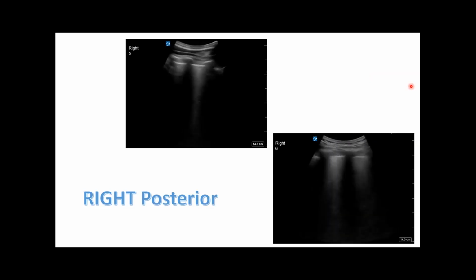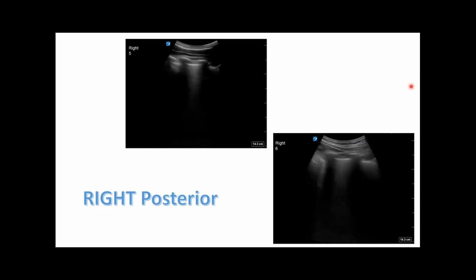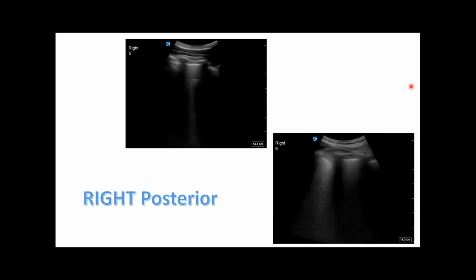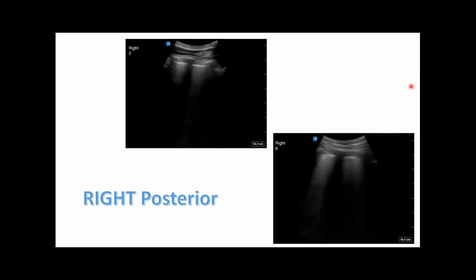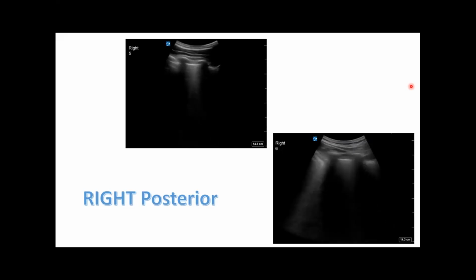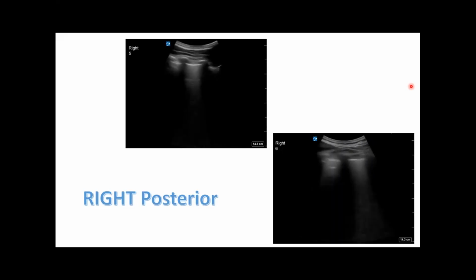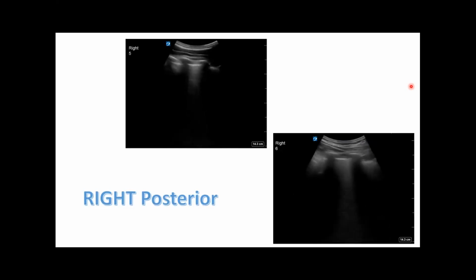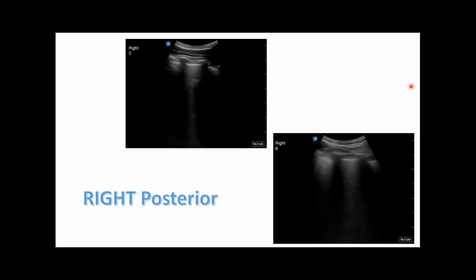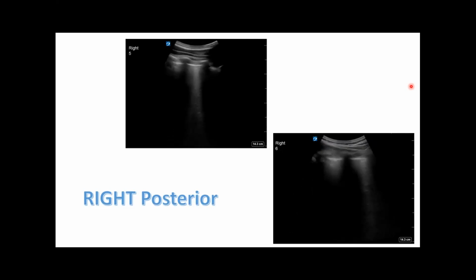Thank you. This is also something that you guys theoretically could do when you're evaluating patients on the floor for like code blues too, right? Like, you're not going to get an x-ray immediately. And they make portable ultrasounds that can hook to your phone or tablet or all-in-one devices. So, I mean, you're going to listen to their lungs, but maybe at some point you'll put an ultrasound on bilateral lungs, because literally what Dr. Imponza is saying, we do this in the resuscitation bay, and it dramatically changes management as well.